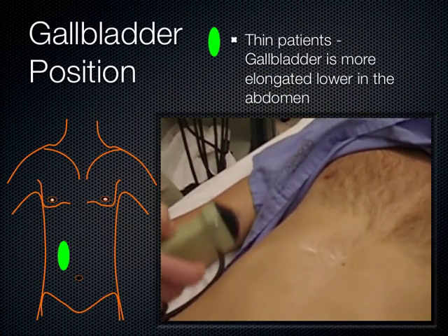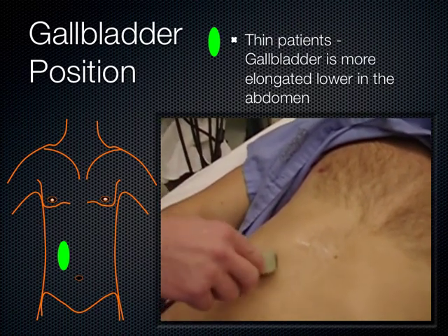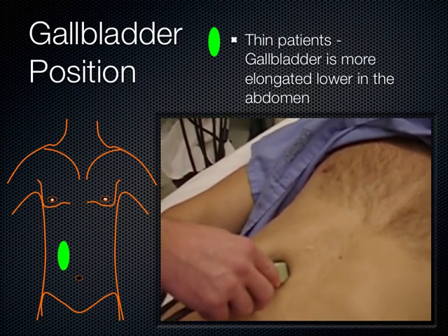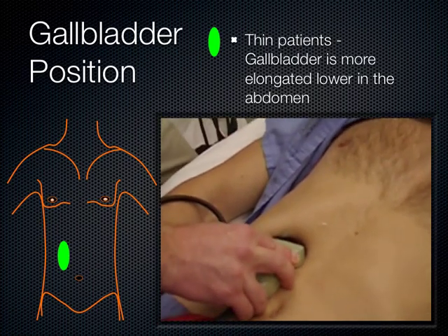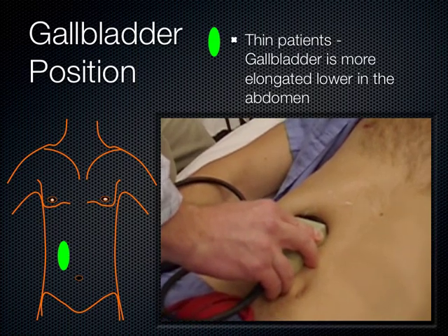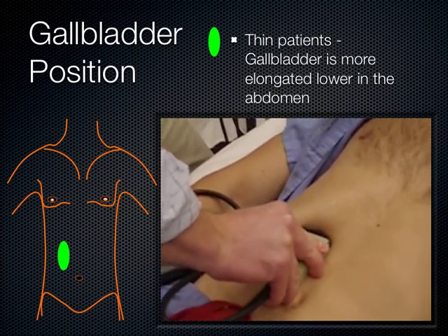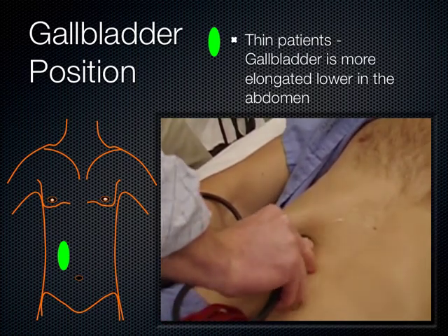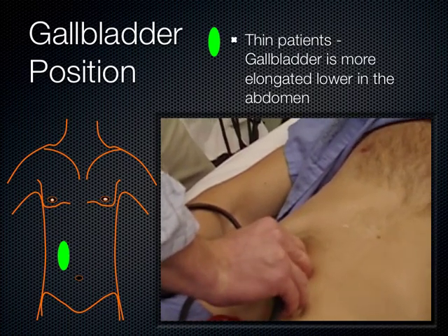In young thin patients, we tend to find the gallbladder more lateral and anterior. In those patients, if you can't find it with the subcostal sweep or the X-7 approach, it's often helpful to take the indicator and really flatten it out against the abdomen. The indicator is pointed towards the patient's right. The probe itself is flattened out as much as you can. You kind of fan through the gallbladder anterior to posterior as you work your way laterally. And oftentimes you'll find the gallbladder up in this area here.